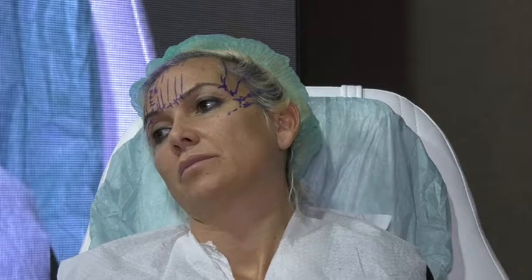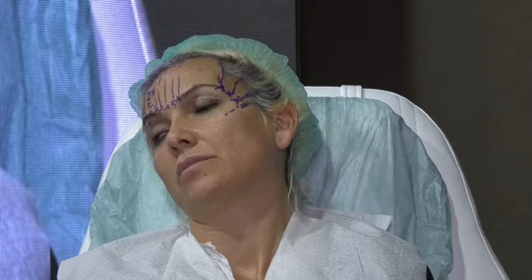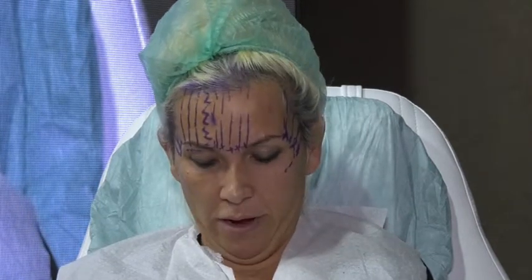When you have, at the end, you have a part of the thread flipped over. You know that, right? There's a blue part of the thread. Do you think this one should be in the loose area or in the tight area? Should it be in the anchoring area or in the free area? The fixation one, this one.